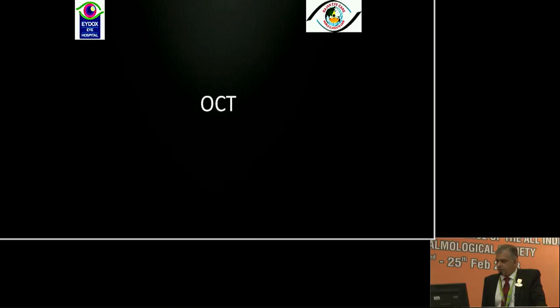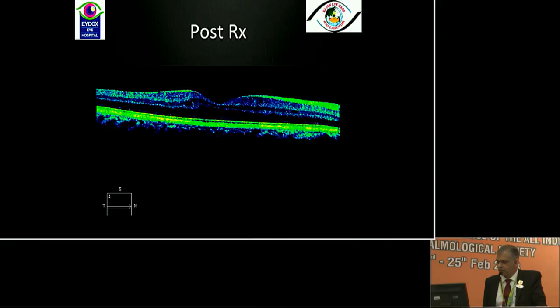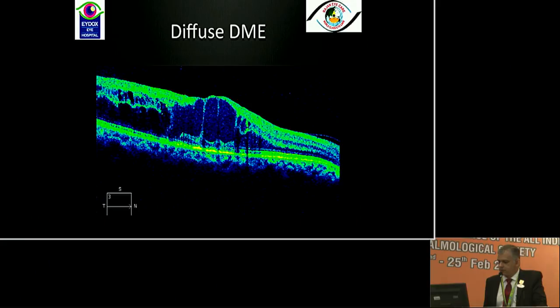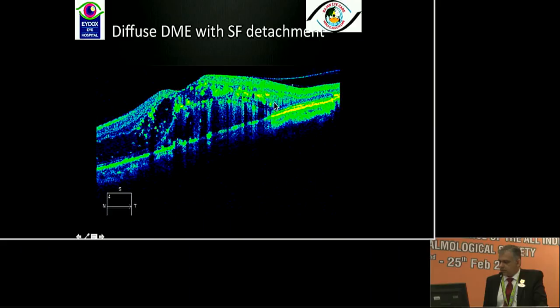OCT has changed understanding of this disease. Focal edema is easily treatable with intravitreal agents — this is immediately post-treatment. Diffuse DME has been reclassified into subtypes: early spongiform, massive spongiform thickening, presence or absence of neurosensory detachment, and so on. Diffuse DME with large cysts will require repeated sessions of treatment. There is also disruption of inner and outer retinal layers and more of a schisis pattern, as we can see here.